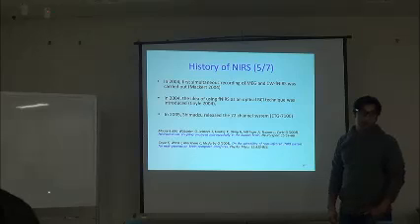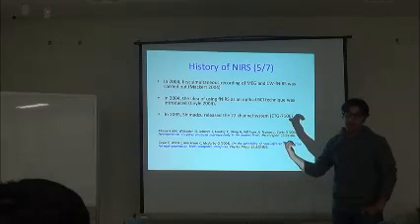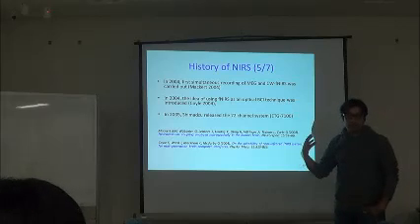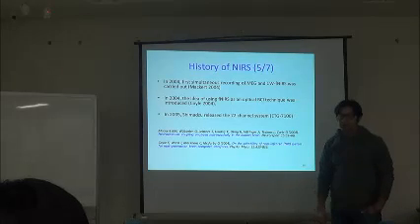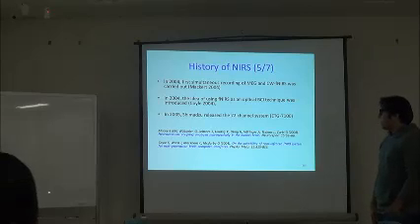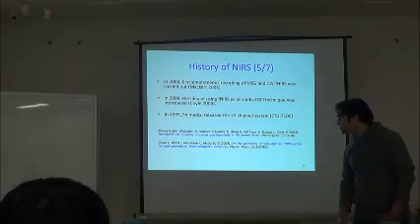Before that, it was never used for brain-computer interface, just for getting the values of concentration changes to see where the activity is happening, for localization and detection of activities, but not for the brain-computer interface. Well, in 2005, Shimadzu released the 72-channel system. This is a very famous machine as well.